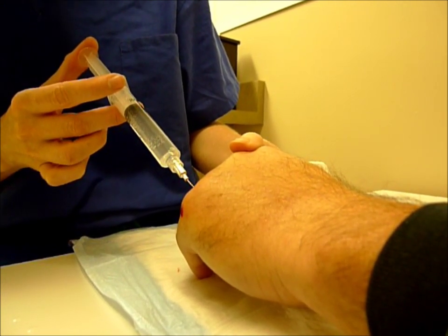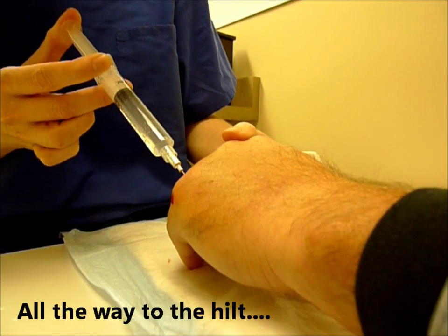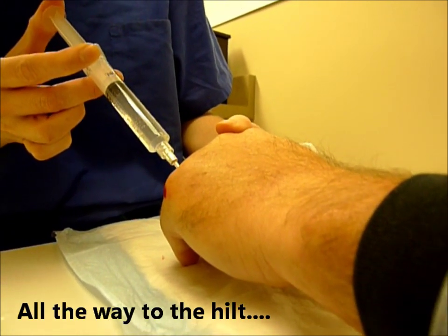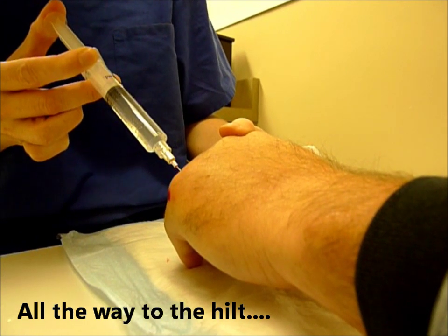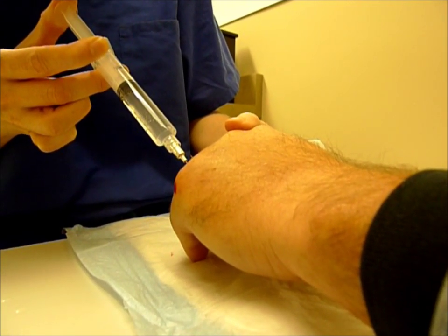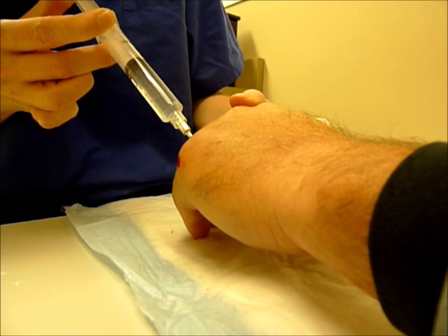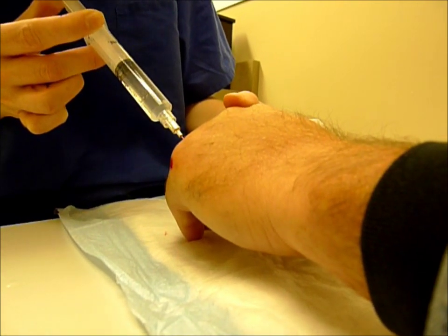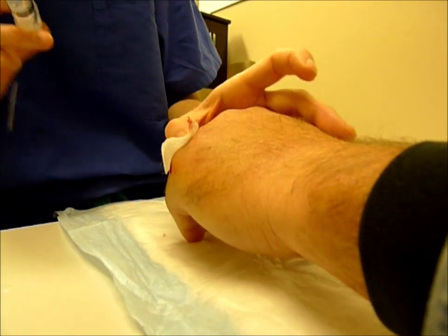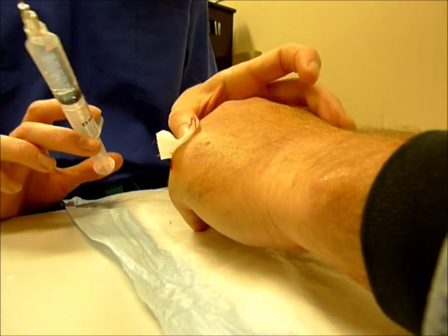Okay, I'm going to take a break here. This is still better than last time — really good. This is making me ill to watch. Please don't faint on me. I'm the photographer — I can't faint. I can fix your face, but I prefer not to. There we go. That was way better than last time. Let's make sure it works.